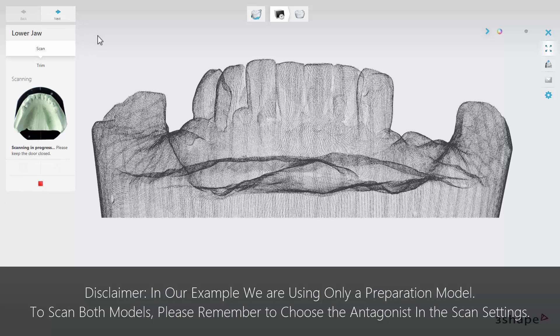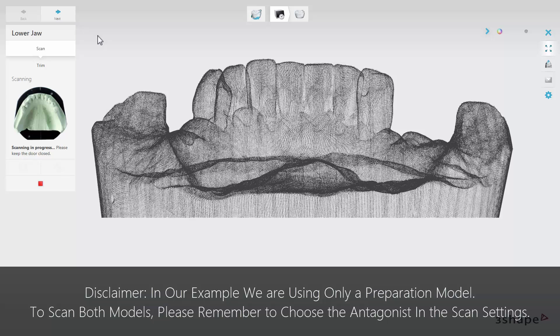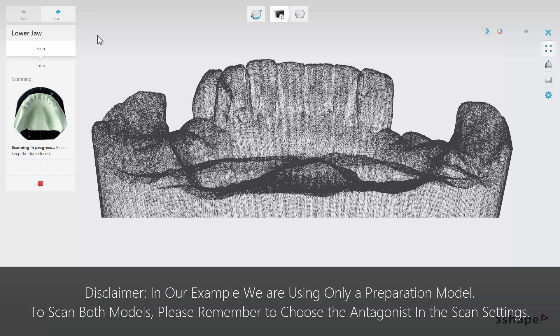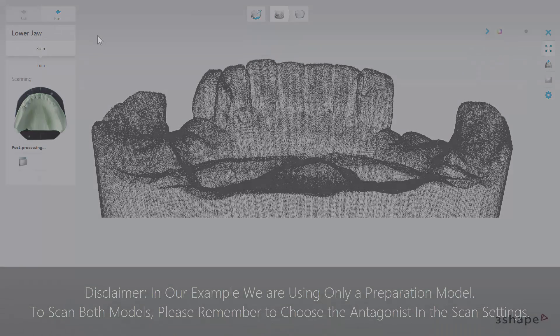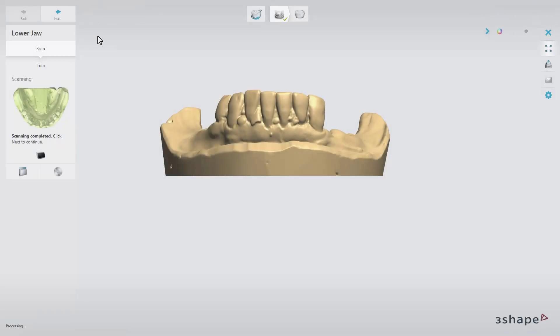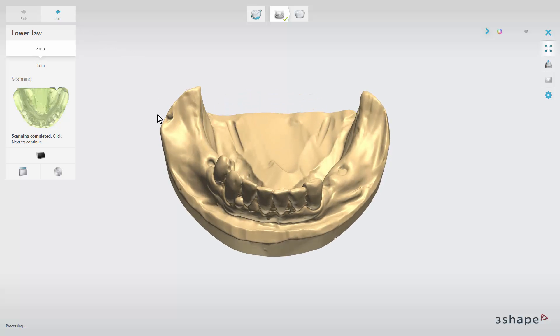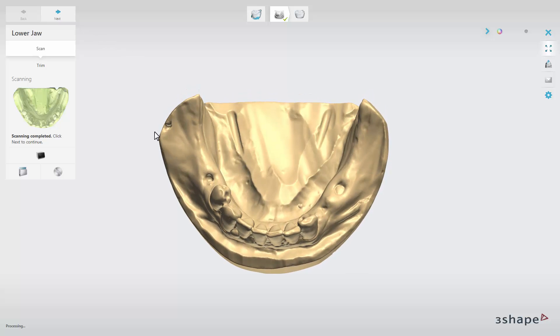While the scanning process is in progress, prepare the antagonist model and repeat this step for the opposite arch and later for the bite registration. When the scanning procedure is completed, you can see the prepared model on the screen.